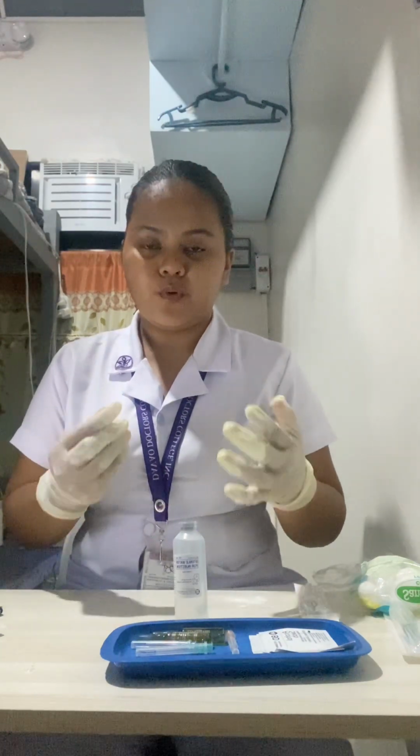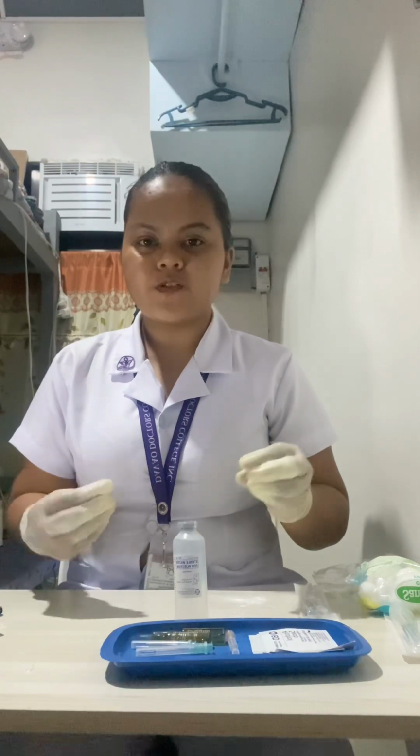Now that I have performed proper hand hygiene and put on clean working gloves, I am now going to prepare the medication. First, I'm going to mix the solution, especially since some solutions contain an aqueous suspension, which tends to settle if the vial is kept standing.